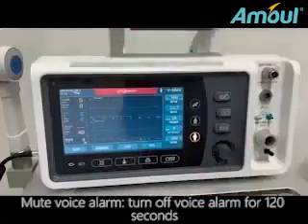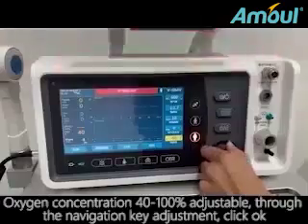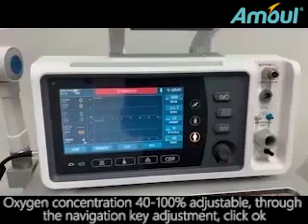Mute voice alarm: turn off voice alarm for 120 seconds. Oxygen concentration, 40 to 100% adjustable. Adjust through the navigation key, then click OK.